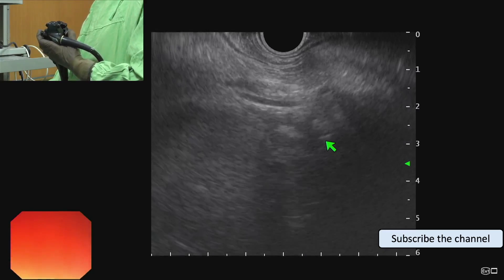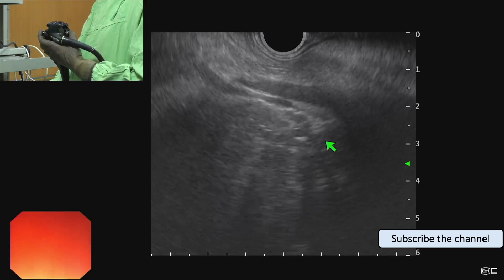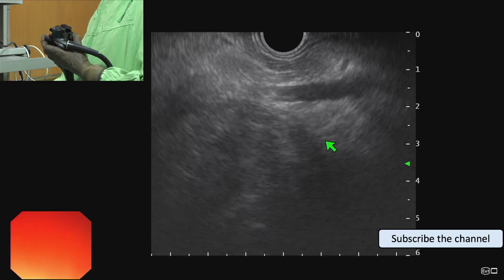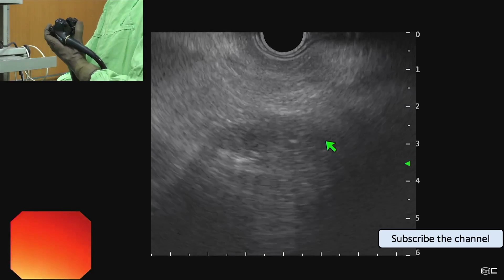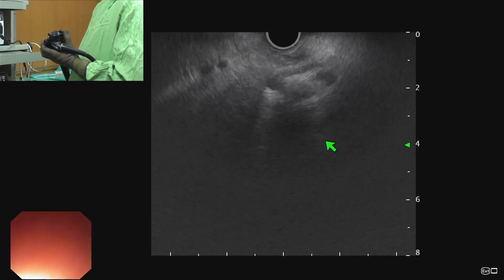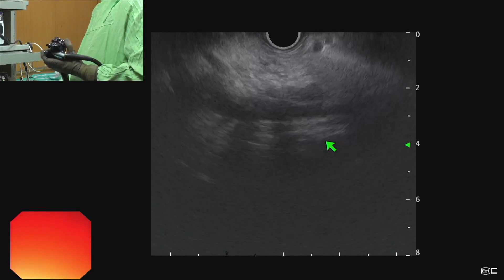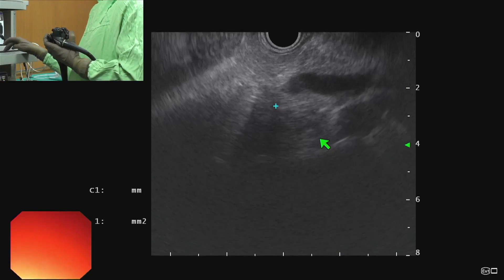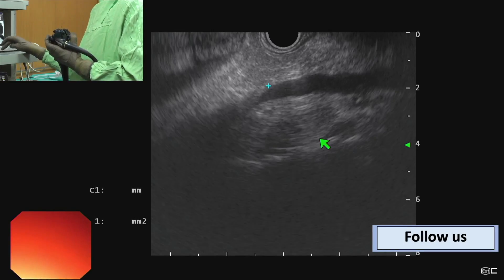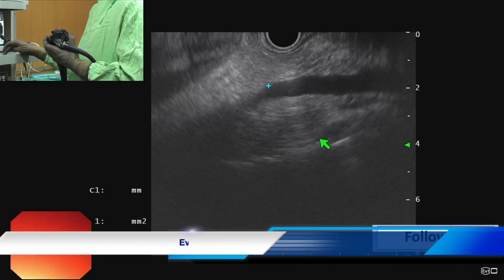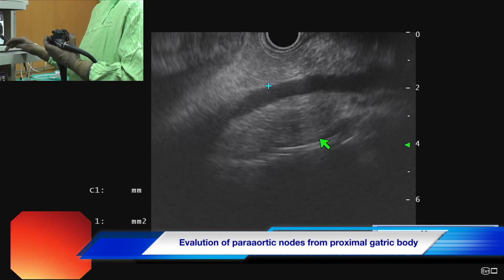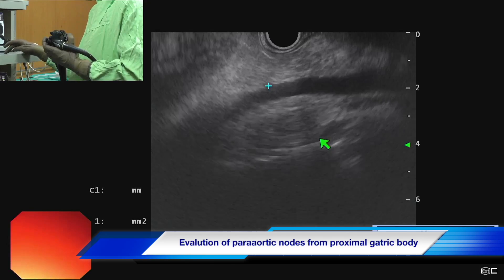Here we are seeing two linear vessels — the SMA and SMV — and we can see there are no significant nodes in this area. Next is evaluation of para-aortic nodes, which can be done either from the proximal stomach or the second part of the duodenum.